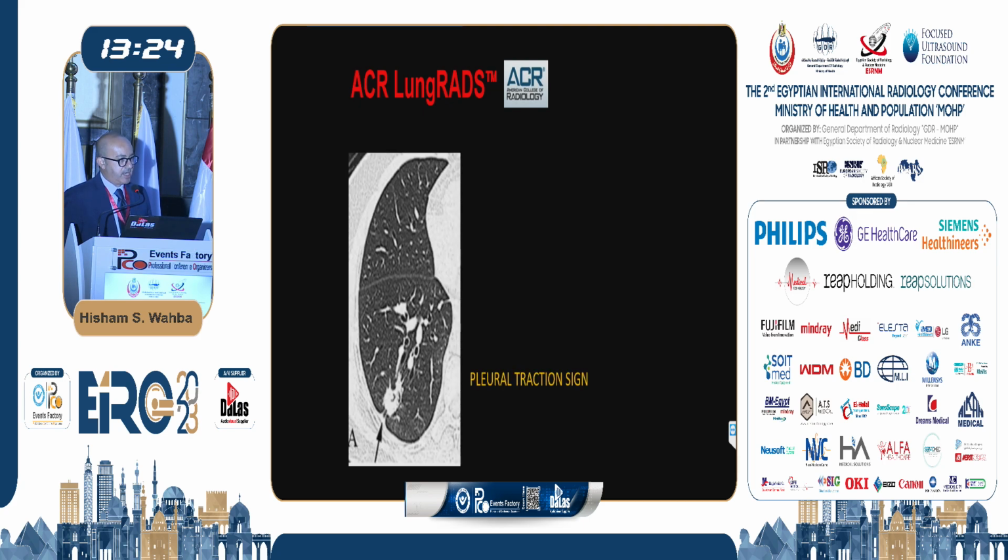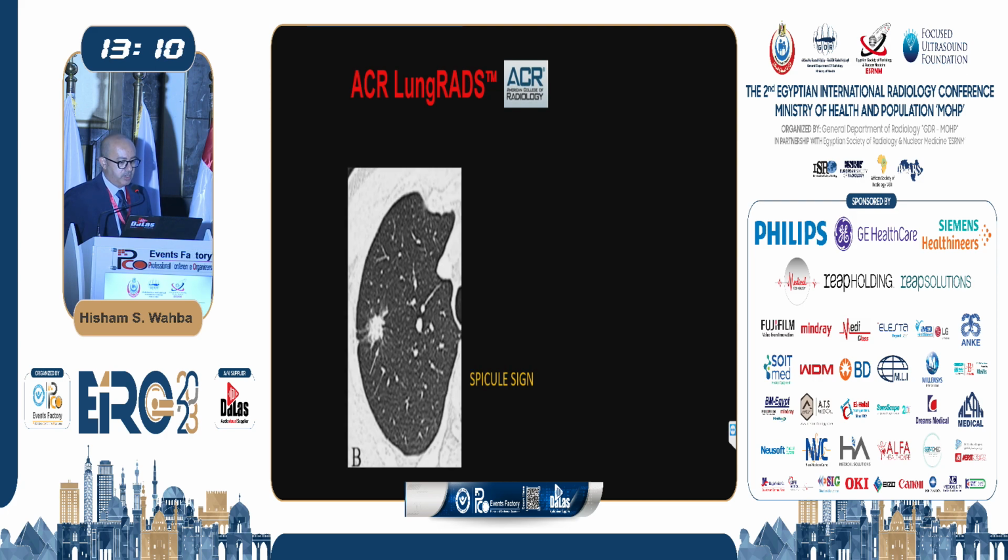So there are several signs which can raise the possibility of malignancy, like the pleural traction sign, which applies whether the nodule is large or small, whether it is falling in a certain category of Lung-RADS or not. Again, if you have a traction on the pleura, this is most likely a malignant nodule. So it should be taken into consideration.